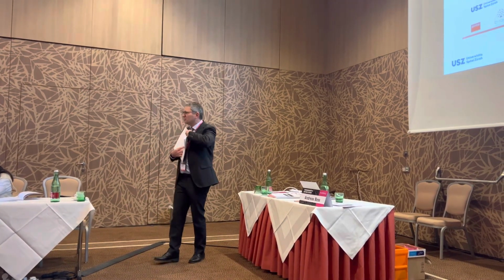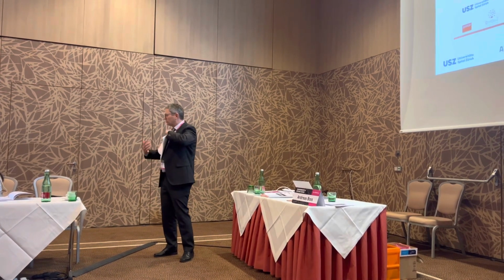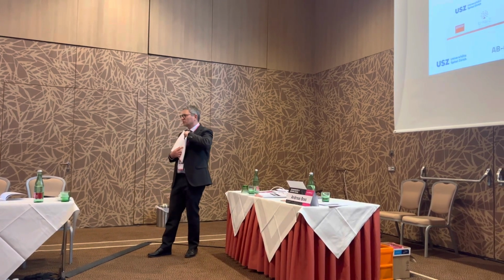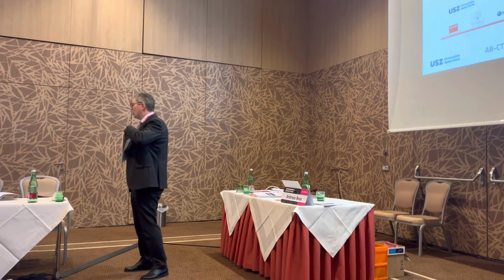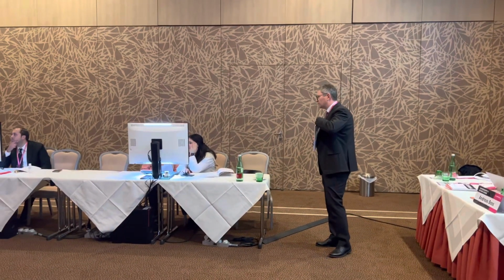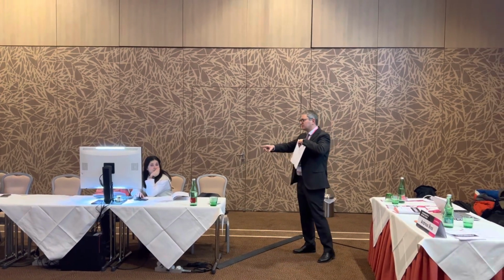Then you can try to get MIP reconstructions, whatever, and you can get familiar with the PACS system that you are using. Later on, it will tell you that you could look at an AI evaluation of breast CT or of the corresponding mammography. You can do this in the web browser, which is installed on your PACS systems.